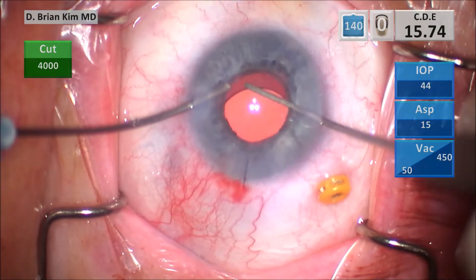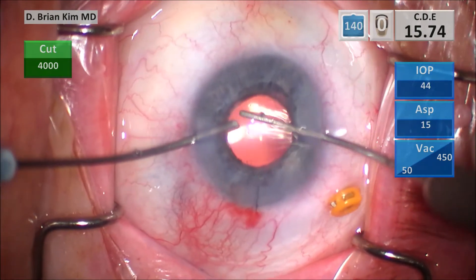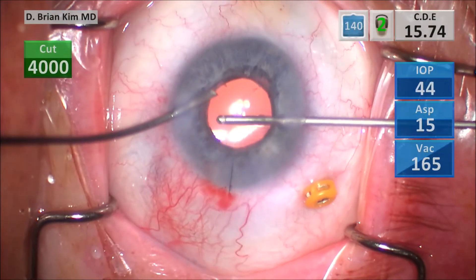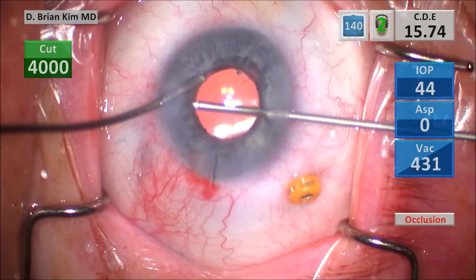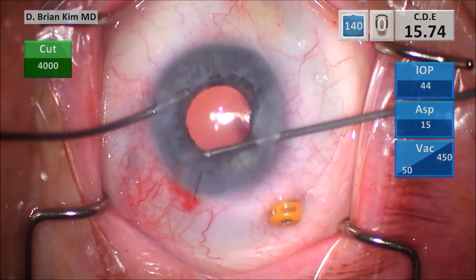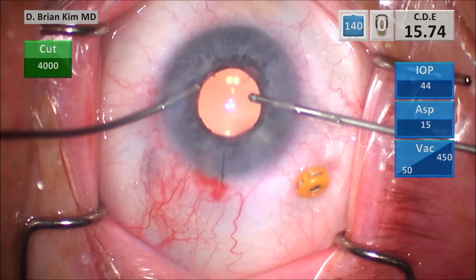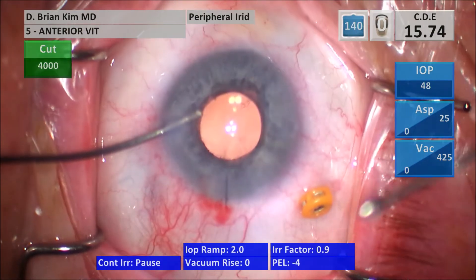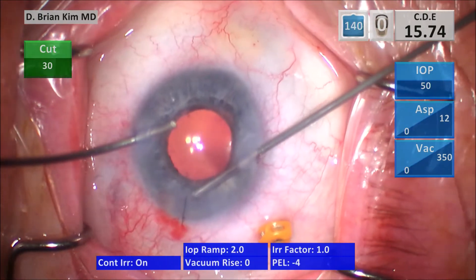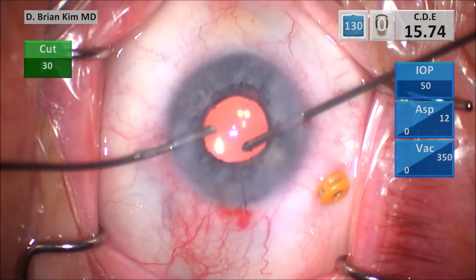It's important that in cases of vitreous loss where you've been hydrating the vitreous throughout the case, the entire chamber is going to shallow and it's really a challenge because you're fighting against yourself. But you saw immediately once I placed the trocar and did just a little pars plana vitrectomy, the chamber opened up so nicely — the lens fell back, the iris diaphragm fell back, and I had so much more room. Doing vitrectomy both from the posterior side and the anterior side, I'm able to make sure there's no vitreous whatsoever in the anterior chamber. This also contributes to better IOP control post-operatively — vitreous loss without adequate vitrectomy creates a very crowded anterior segment.